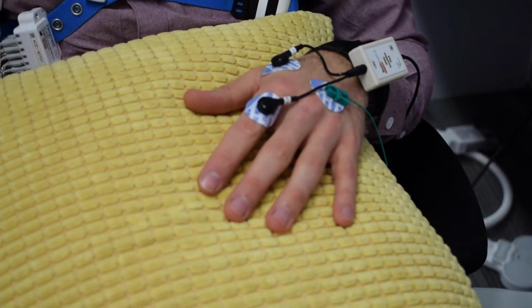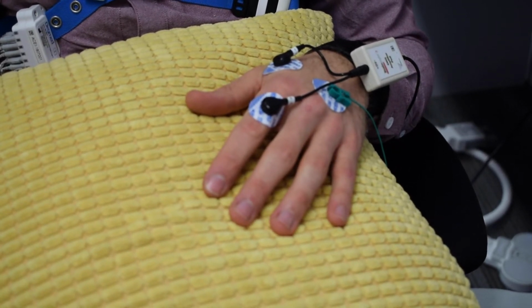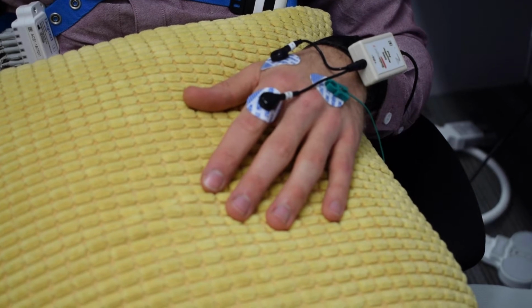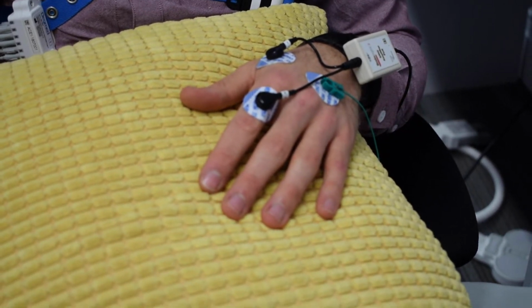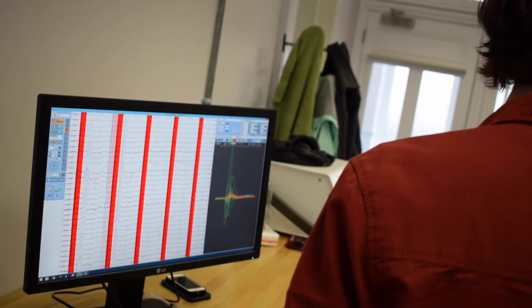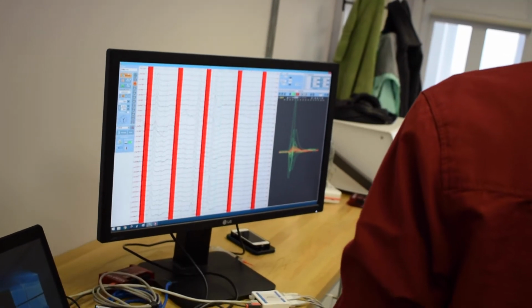Resting motor threshold is used in most TMS studies, but an active motor threshold would be more commonly used in instances where it is difficult to elicit an MEP from the target muscle, for example in patient populations with movement disorders. In activating the muscle slightly, we prime the neural pathways, making it easier to elicit an MEP.